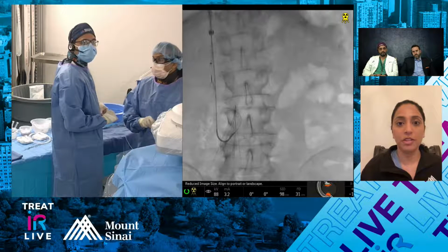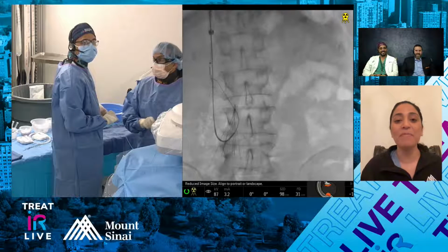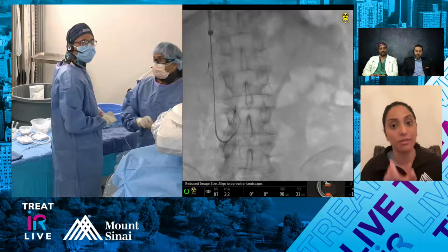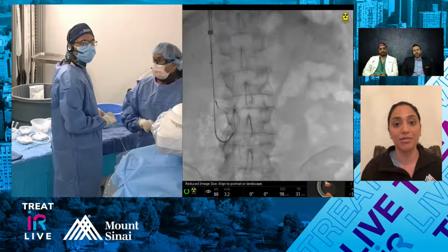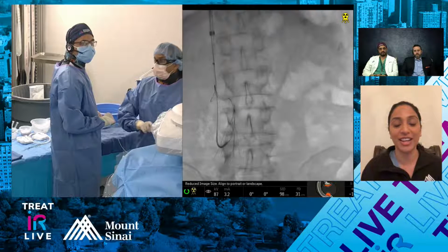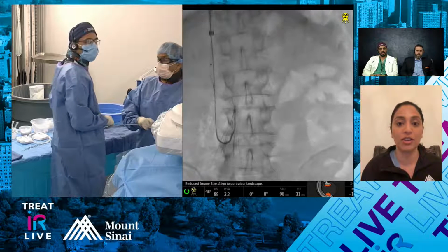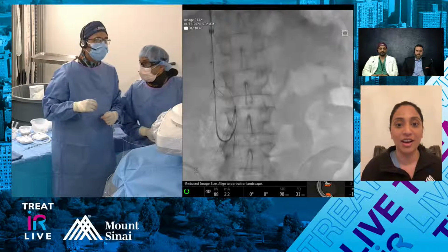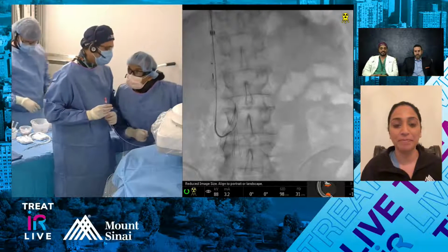Yeah, I think same. For these types of filters, I would probably go to forceps within the first 5 minutes of trying. But I have had patients where I have not had them under general anesthesia and they have reacted to the forceps. You could be in there with the forceps and the patient feels every movement, and at that point I have attempted to do it with the hangman technique. It does kind of work to peel that filter towards the center of the cava. A number of times, it just takes a lot of patience and perseverance. Try it with a Contra too.